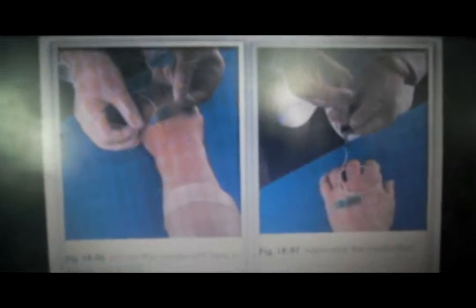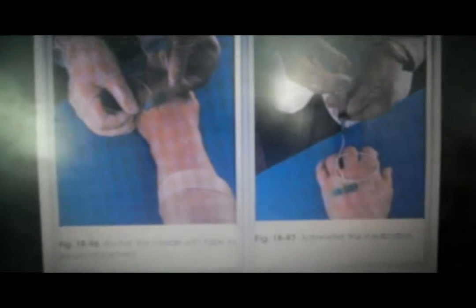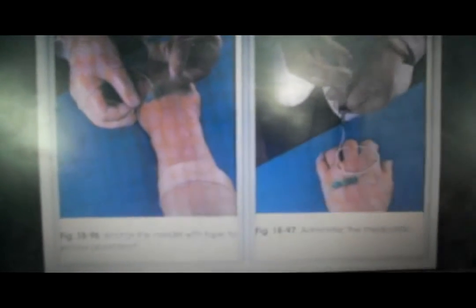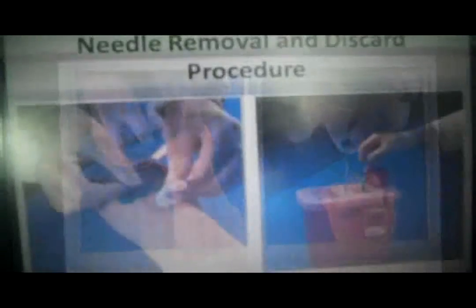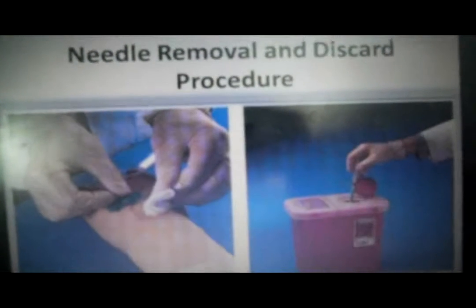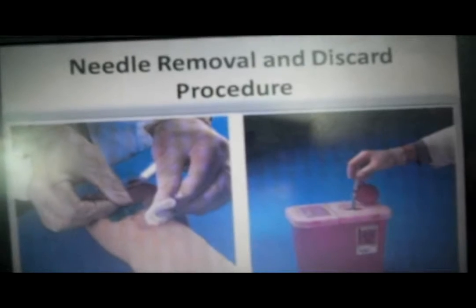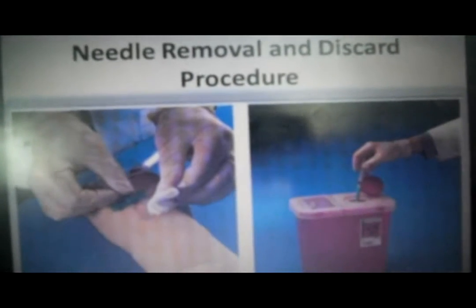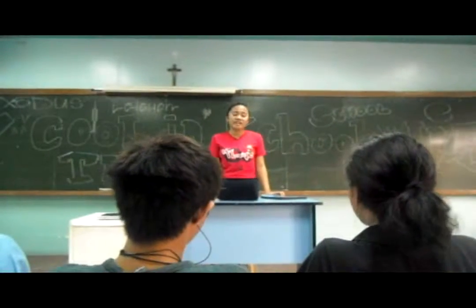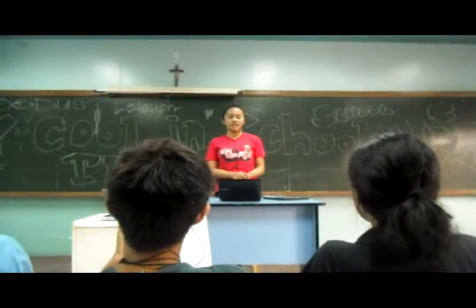Anchor the needle with tape to secure placement and administer the medication. Needle removal and discard procedure. Remove the IV access. After that, discard needles in a puncture-resistant container. Never forget to explain the procedure to the patient.